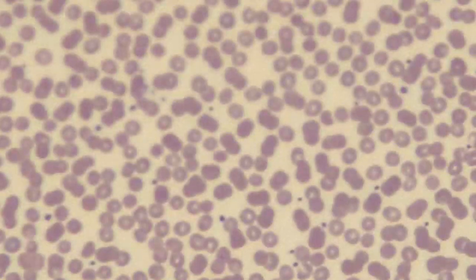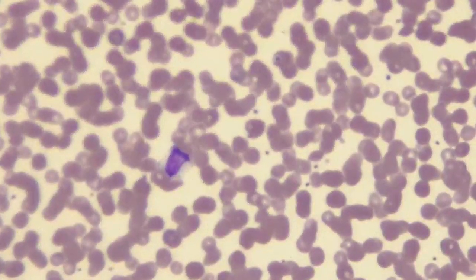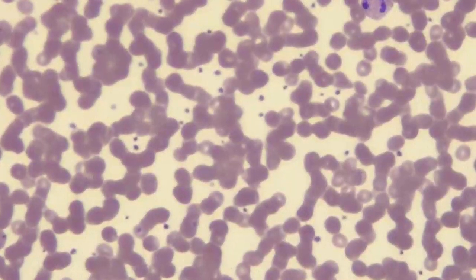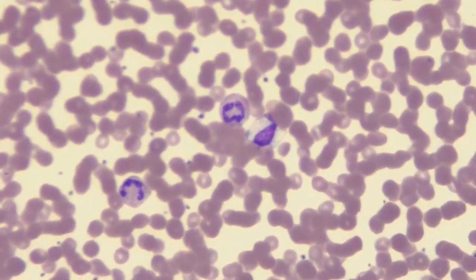Now on the other end, if we go into the thick end of the slide, here we can see the red cells are just on top of each other, and that's not good either. One thing you may notice is that the morphology of the white cells is not ideal when you go back here, because they start to get a bit condensed. For that reason too, we really wouldn't want to do an assessment of the cells way back here. So let's go back out to where we think would be a good starting spot.